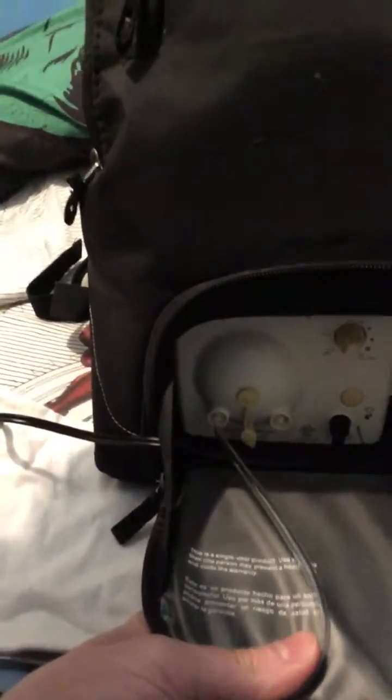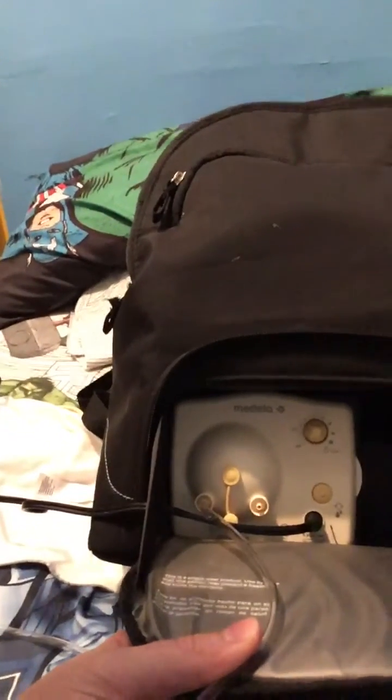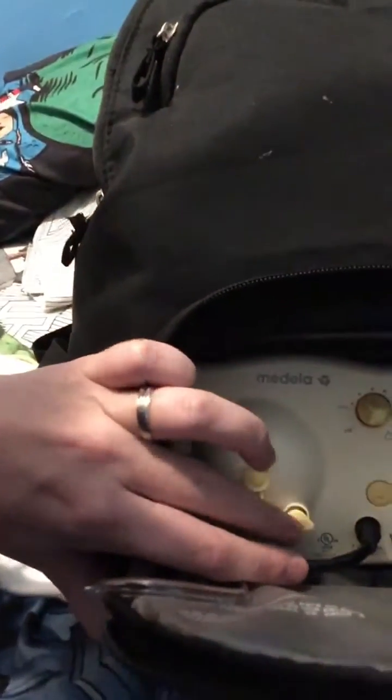Boom. That's it. And then you would repeat that on both sides. If you decide that you're only going to pump on one side, there's that little rubber yellow connector piece right there. All you do is take it and plug up the other hole on the other side, just like that. You can see it right here. I moved that over, so that will cover up the suction on the other side so that you can just pump on one side if you don't want to use both. If you want to use both, of course, you would just put the other tube on the hole.